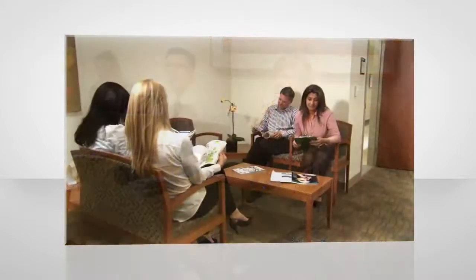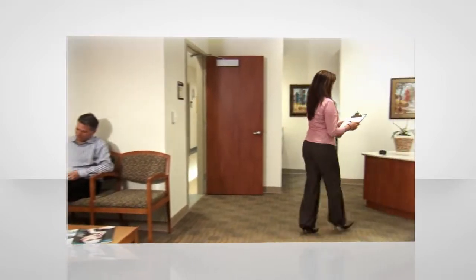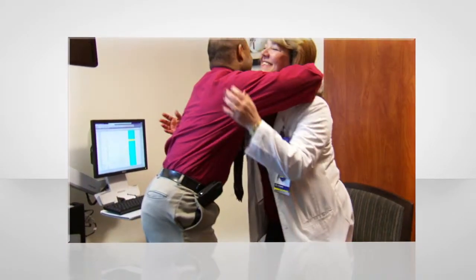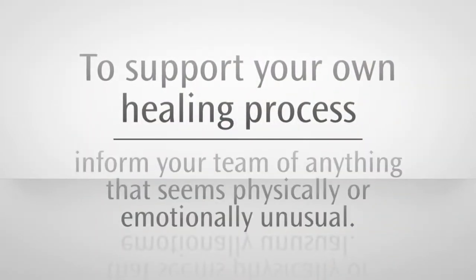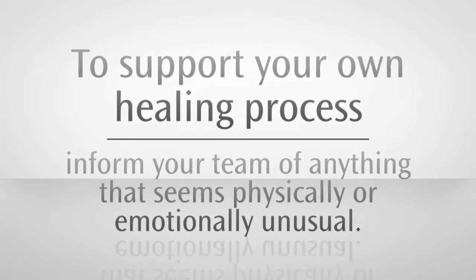You may have thought of additional questions about your radiation treatment while watching this program. Your cancer care team is your best resource for answers that are specific to your case. Write down your questions for your next appointment so you can get all the answers you need to guide you on this journey. Remember, you are also an important member of the care team. To support your own healing process, inform your team of anything that seems physically or emotionally unusual.